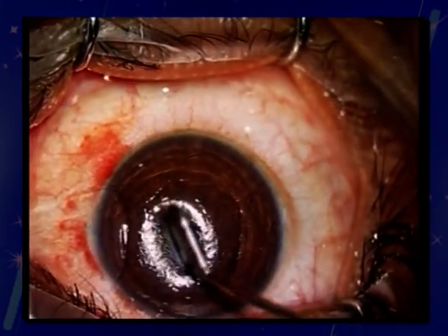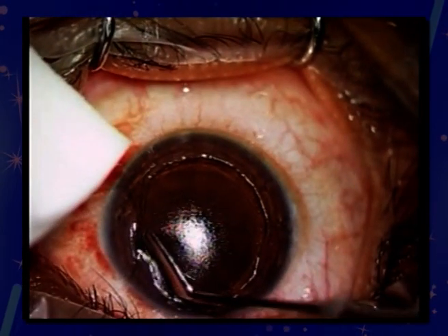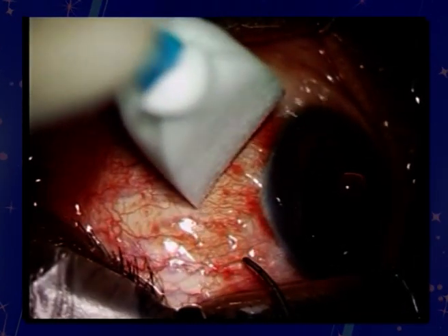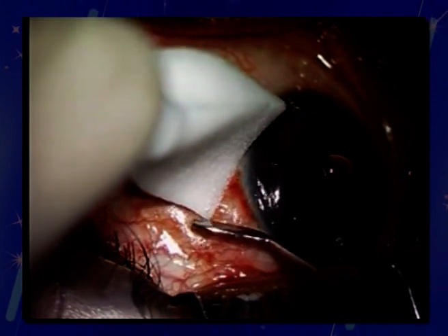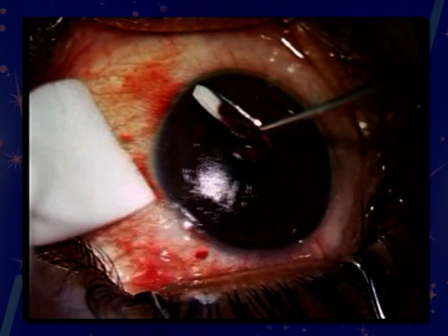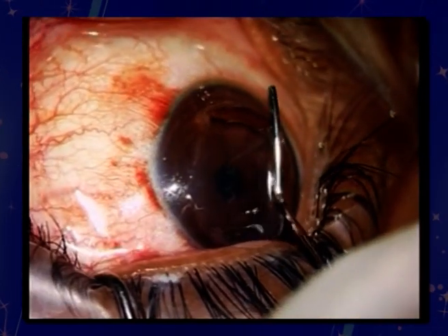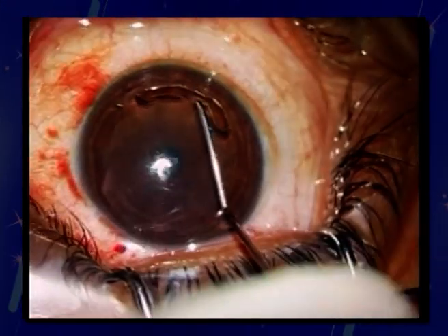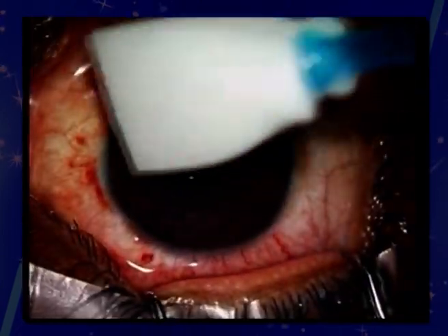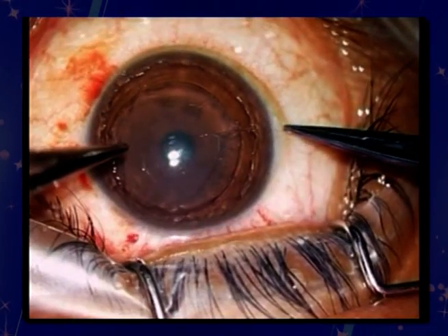The fourth case shows a completely displaced flap with rolled edges. This video shows the importance of removing epithelium under the surface of the flap in addition to the stromal bed. The rolled up flap edges are gently scraped off the epithelial ingrowth and replaced. Suturing the flap is mandatory in this situation to prevent repeat flap slippage and epithelial ingrowth.